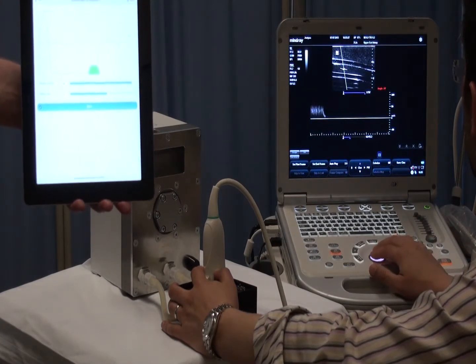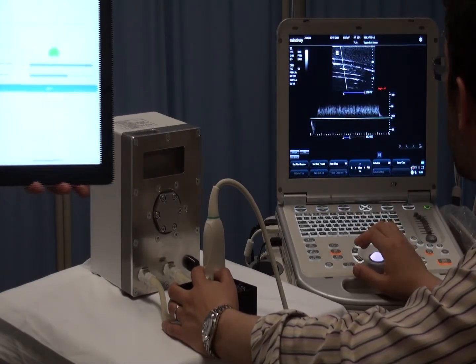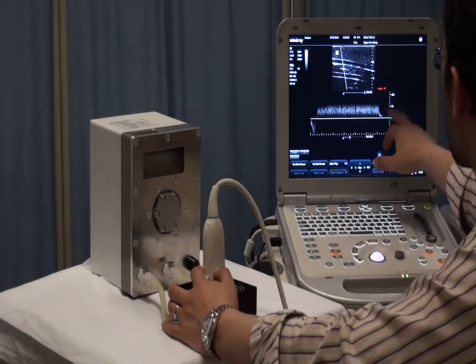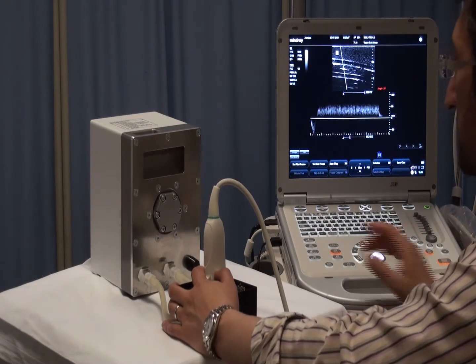Excellent. So the first part here is the calf compression, the augmented flow, and we have a reflux time there of exactly 3 seconds. And we can adjust that as much as we want. Excellent. Thank you very much.